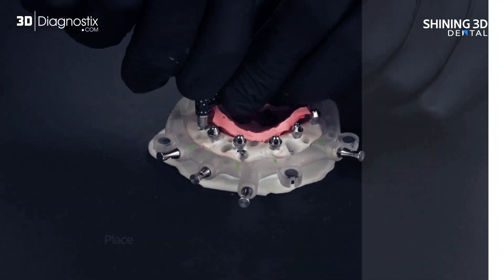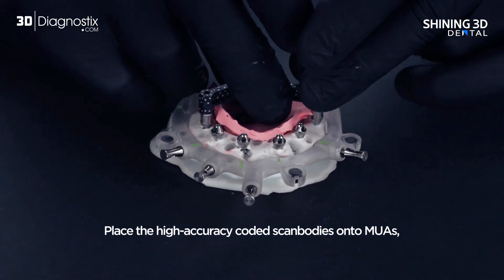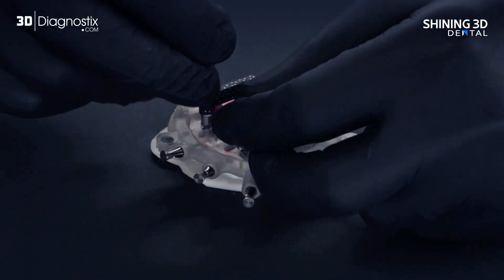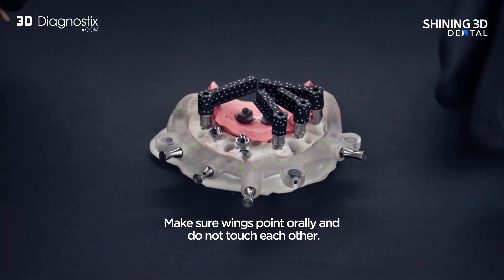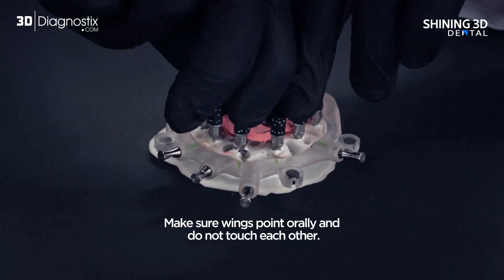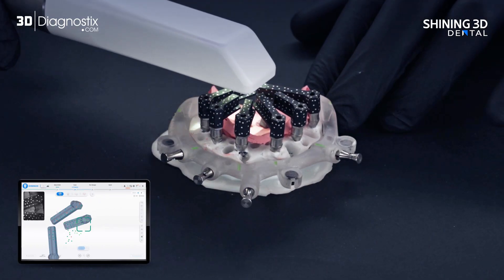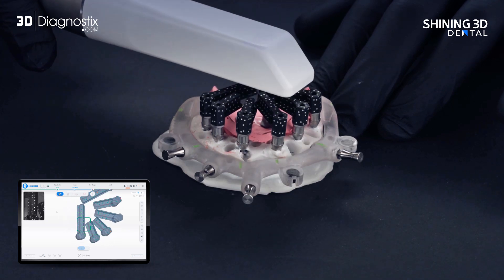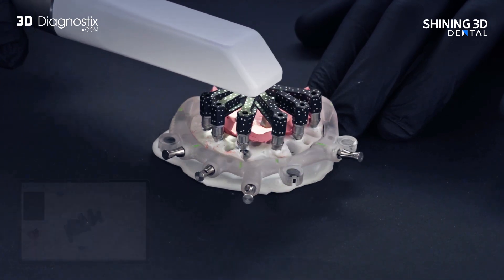Once implants and MUAs are in place, move to post-op scanning. Place the high-accuracy-coded scan bodies onto MUAs, making sure wings point orally and do not touch each other. Begin the photogrammetry scan at the midline, sweeping laterally across the arch. The software automatically verifies each scan body's accuracy in real time.